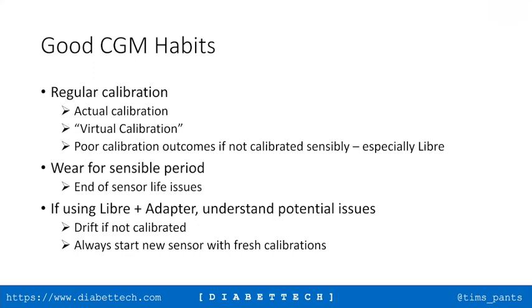Tim, just to ask a question there about the Libre, the Flash. So calibration, so you just take a finger stick test and then would you wait 5 minutes to use the Libre? No. Compare? No. No.